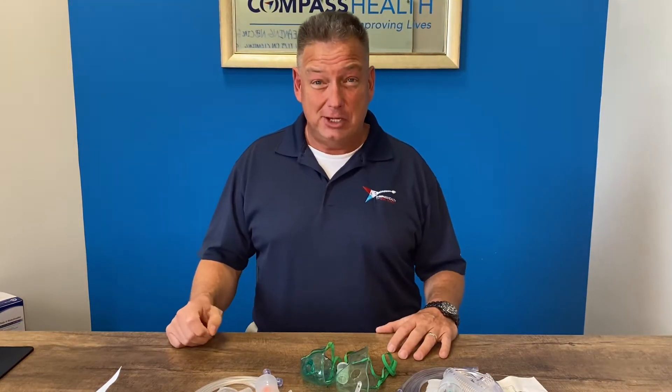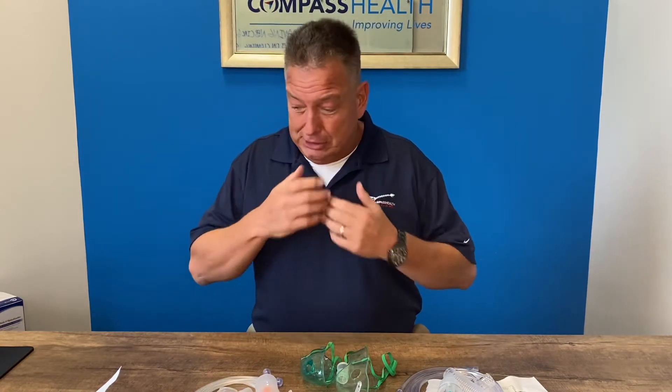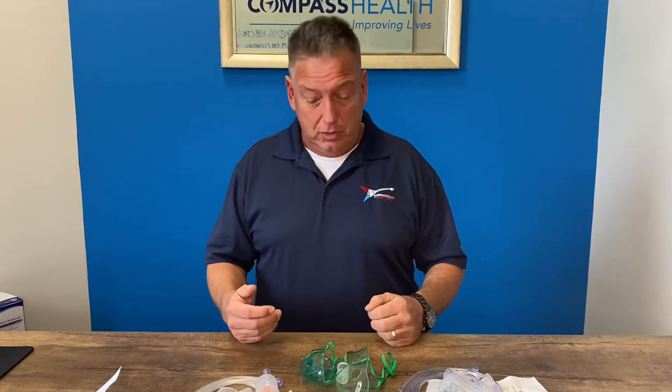Hello, I'm Devin Drysdale, Director of Education with Compass Health Brands, and today we're going to talk about nebulizer accessories — accessories and components for aerosol medication delivery.